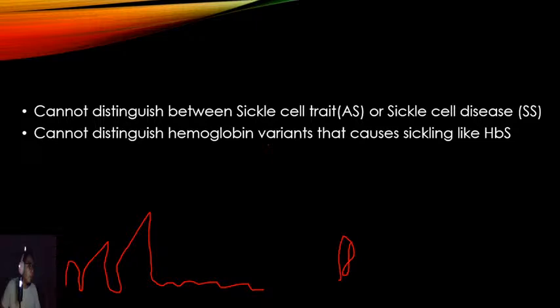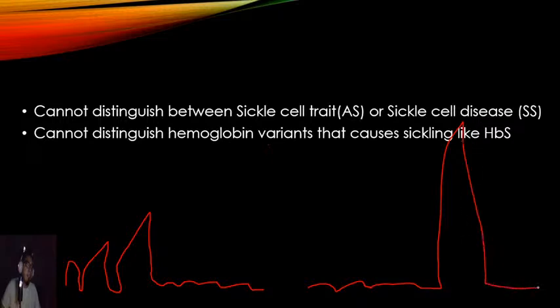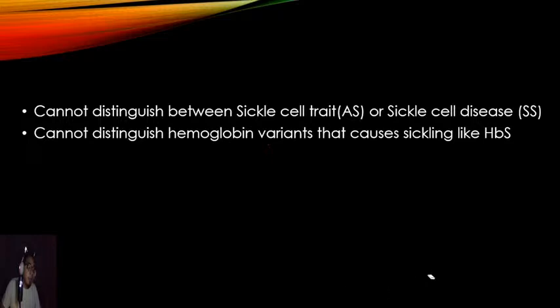Usually for patients with hemoglobin sickle cell anemia, you would see a report similar to this. Hemoglobin A, hemoglobin A1C, hemoglobin A2, something like that, and then everything else. There's a peak at the top. That's hemoglobin S. All right. So, what is the importance of knowing this as medical technologists?